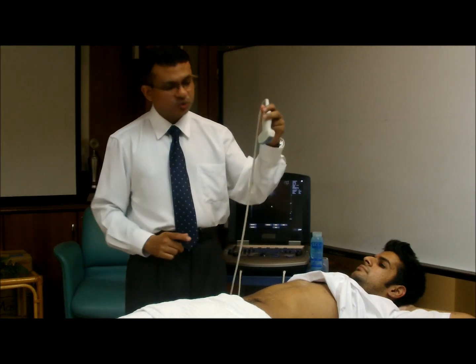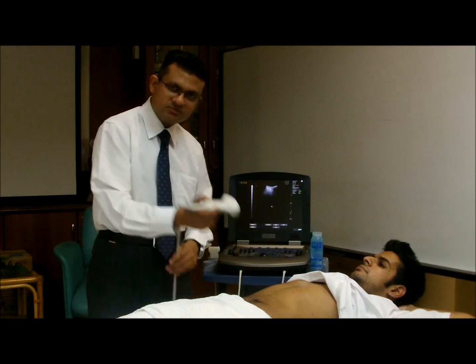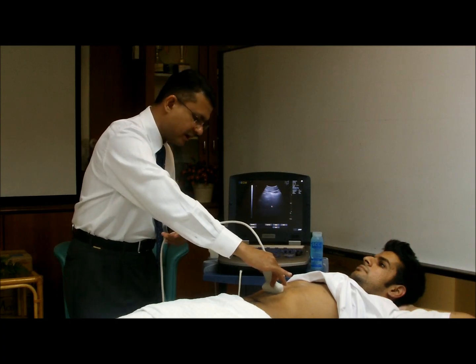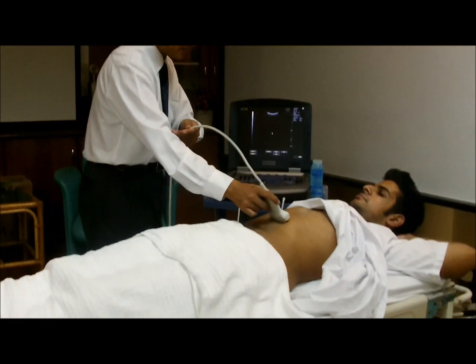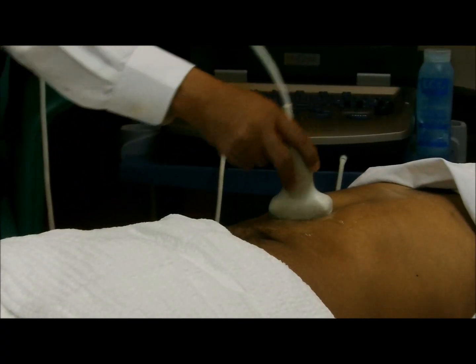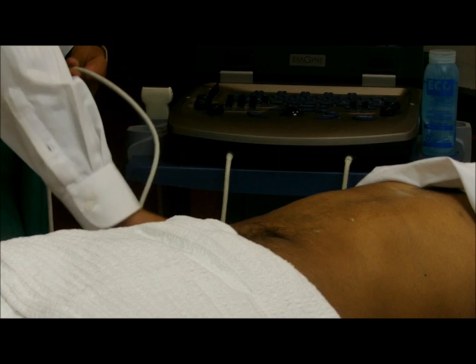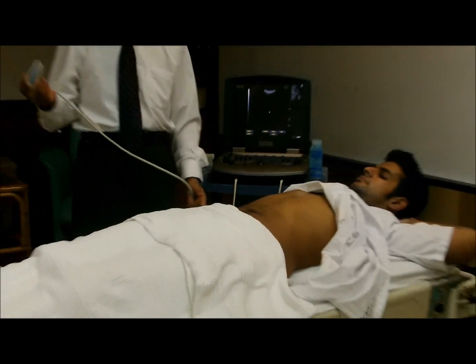You just need to put the probe in this position with the arrow pointing this way, and your movement would be from the epigastric area, and you'll be moving your probe along the subcostal line, like this. You will move it all the way to this side, and along the way you will explore the area of the liver just by tilting it upwards and inwards, like this, as you move away. That is how you'll be able to explore the liver to look for any hepatic abscess. And along the way you would also be able to look at the gallbladder.